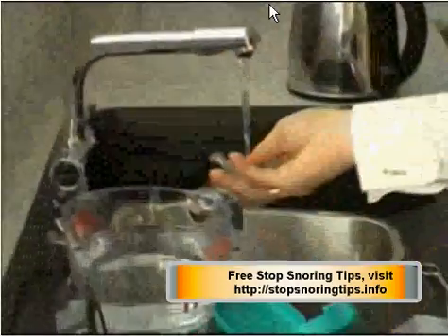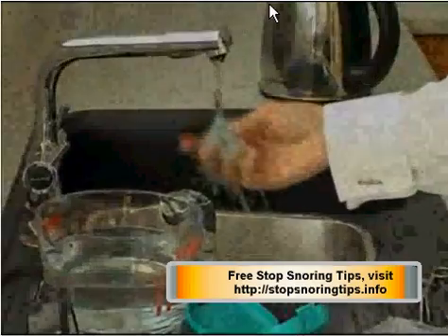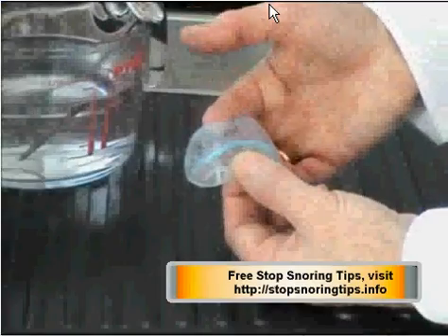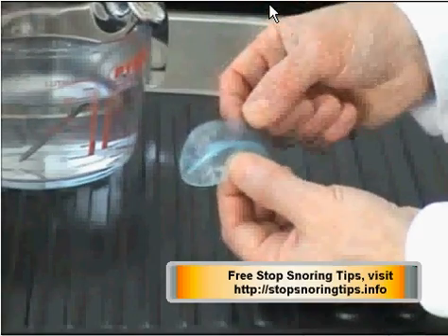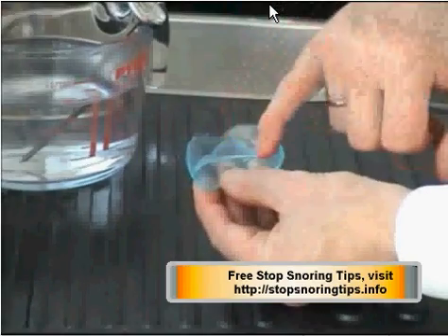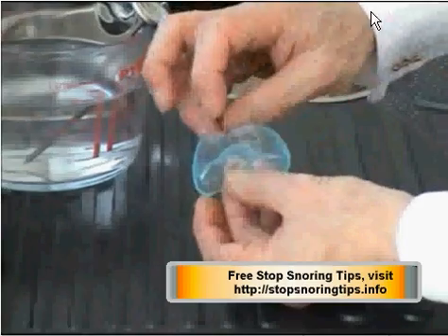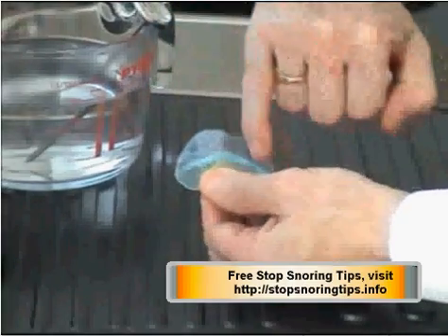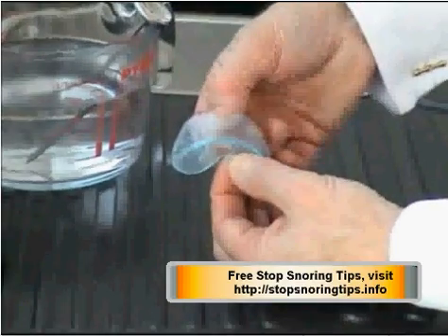That's it, that was for 1 minute. So I've taken it out of my mouth and put it in some cold water until it's back to normal temperature. And you can see that the tab on the inside is now facing upwards. That goes behind my teeth to anchor the device, and that there are some impressions of my teeth in the plastic. Also, you can see how much smaller it is now than when it first started.